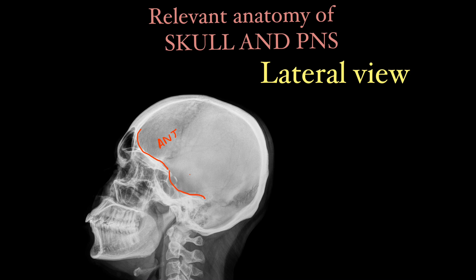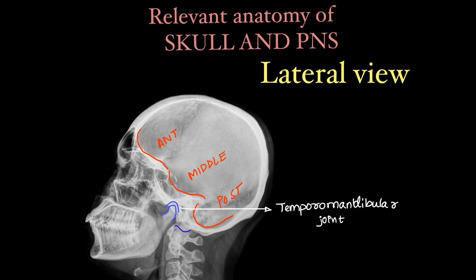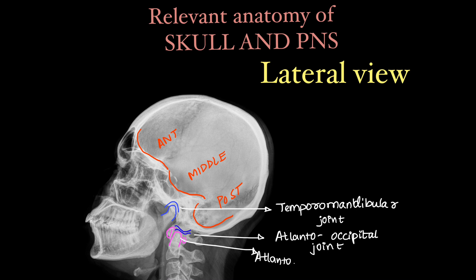On lateral view we can see the skull base. This is the anterior cranial fossa, middle cranial fossa, and the posterior cranial fossa. Here we can see the temporomandibular joint. The other joints we can see are the atlanto-occipital joint and the atlanto-axial joint. These three joints we can see on the skull x-ray.